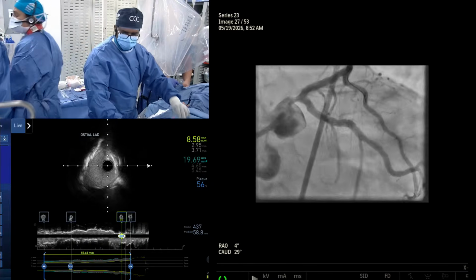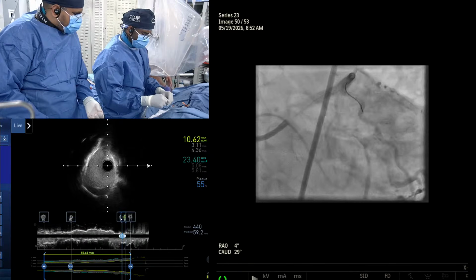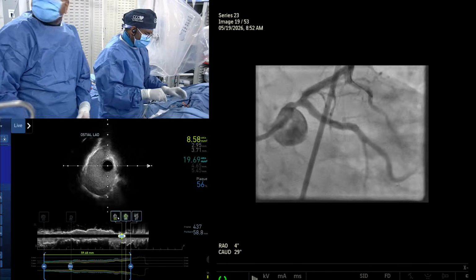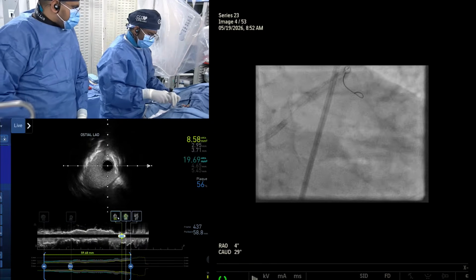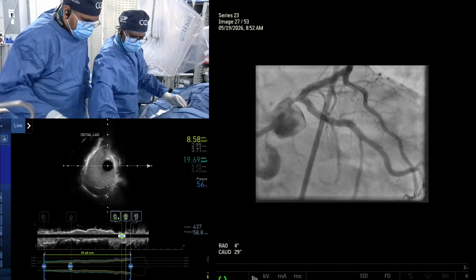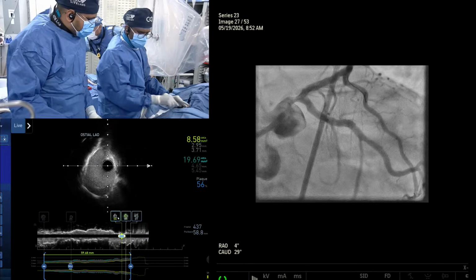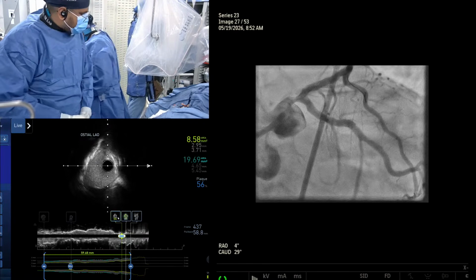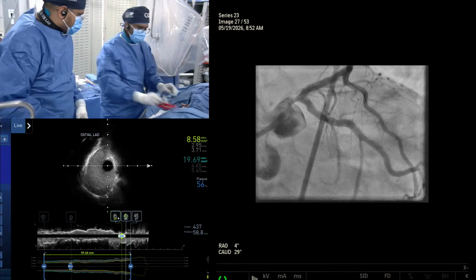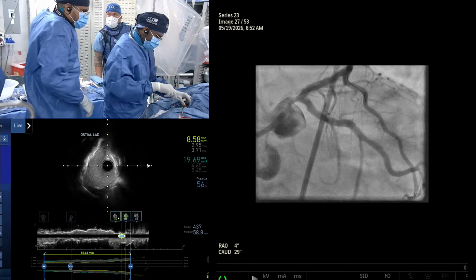When you see a 360-degree arc of calcium, is it okay or not? One thing we do not understand with the imaging, even with the newer imaging, which is deep OCT, is that you still don't see very well. We need to understand the composition of the calcium. I know there are all these criteria for calcium thickness, but there's no criteria for calcium composition based on imaging. If we get that and do a study to understand, depending on the thickness and the composition, do we give 3 pulses, 4 pulses, 10 pulses, 12 pulses? Something more, a study has to be done.